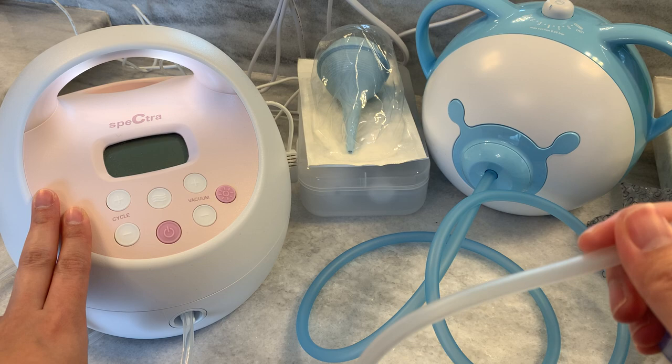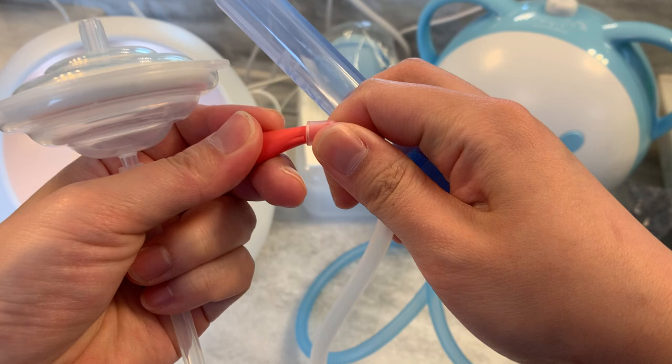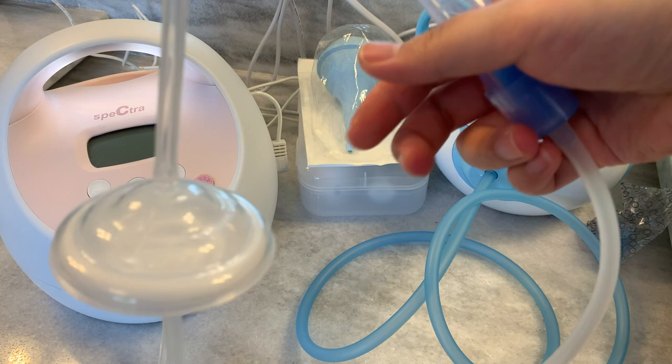If you need an extra level of protection, you unhook the red mouthpiece and hook it up to your backflow protector, so you have a filter here and a filter here. The problem with this is that because of how long the tubing is, you're really increasing resistance in the system, which is going to decrease your suction pressure. But let's give it a try.